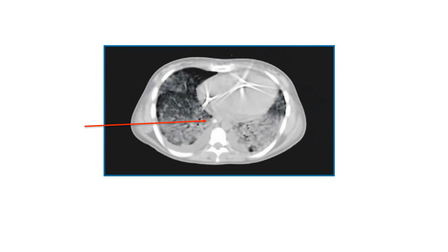So this is where your esophageal catheter will be placed approximately in the esophagus, and the esophagus is submitted to the pleural pressure. It's the same pressure as in the pleural space. But there is not one pleural pressure. And this is very important to understand why there has been this controversy about the absolute value, what it represents.